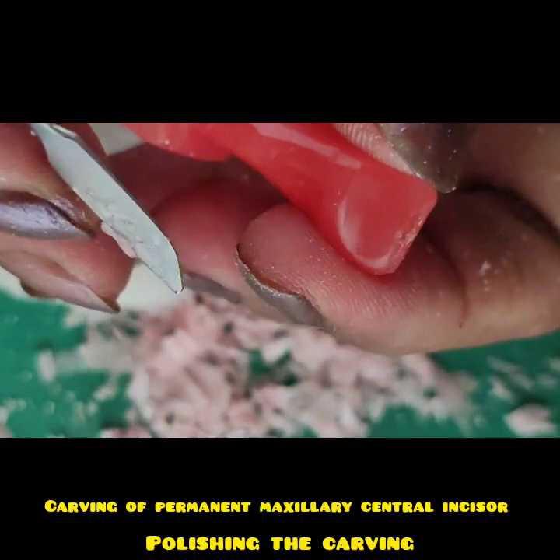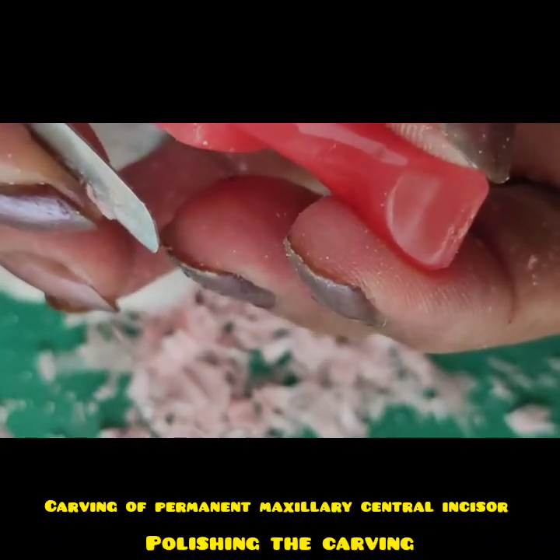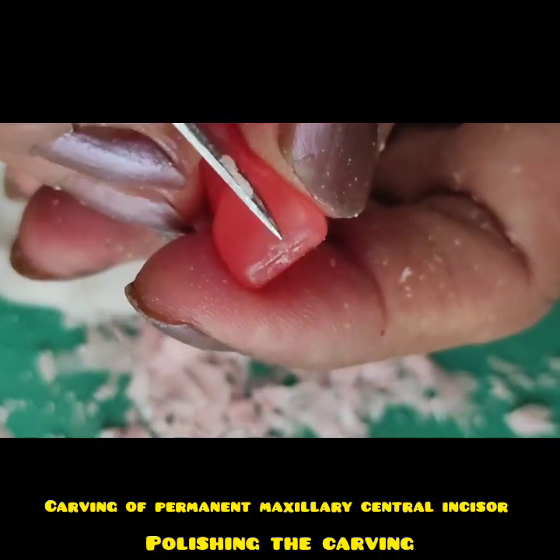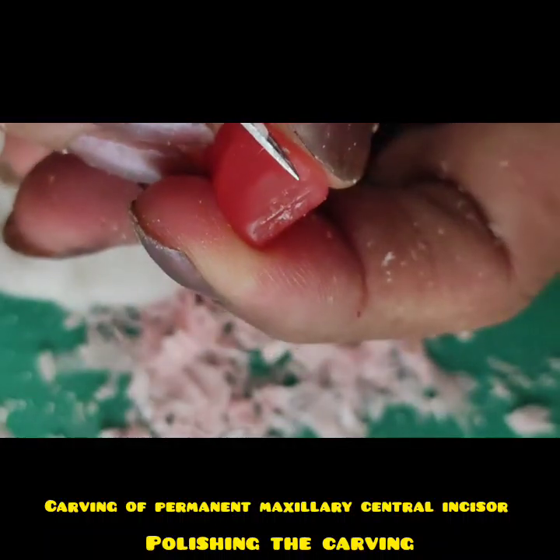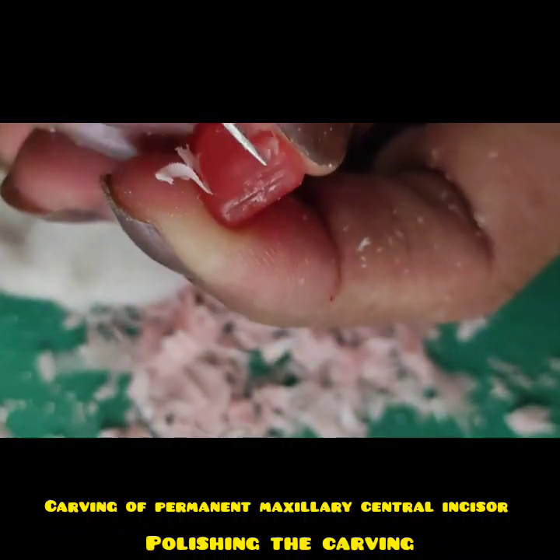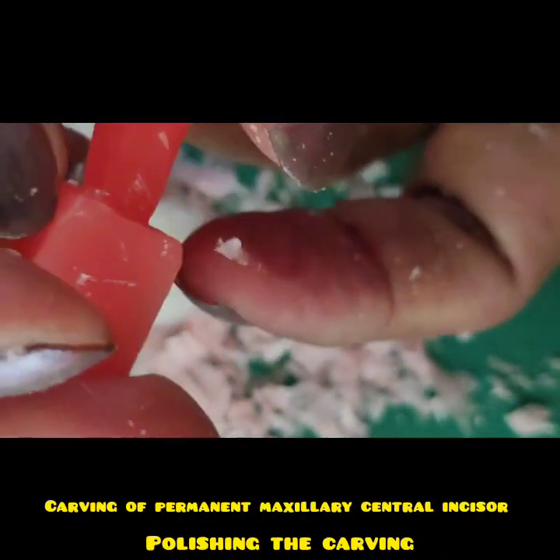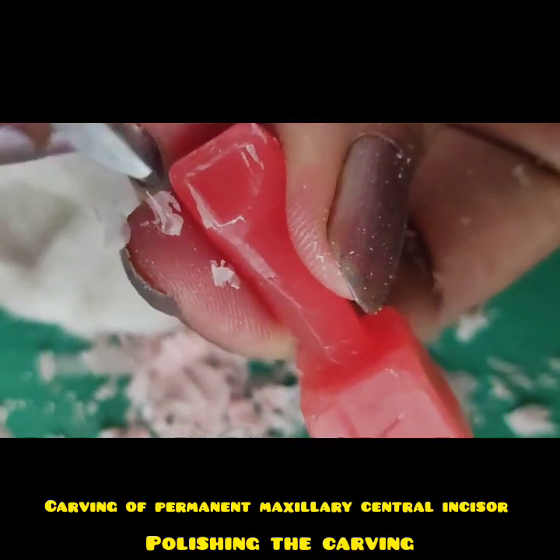For the fossa, what I do is I use this tip of the carver near the cutting edge, and I move along the margins, 1 mm inside all around, so that my incisal marginal ridges also become prominent automatically while carving the fossa.